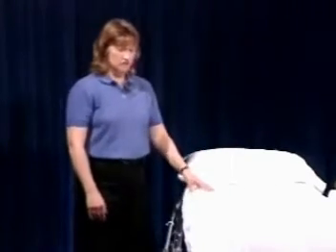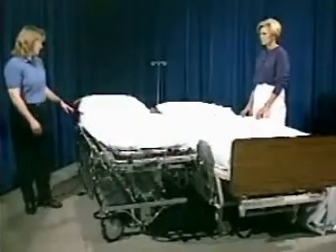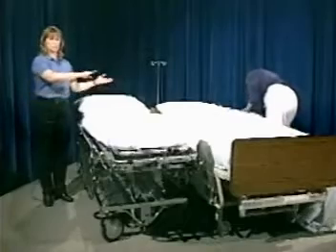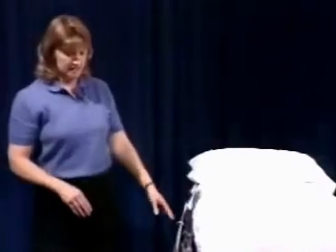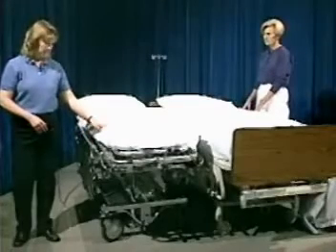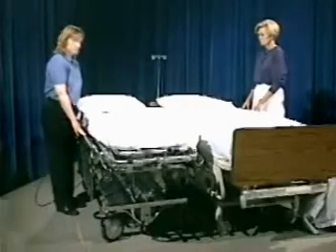With this type of transfer, you need to have the cart or the stretcher flush up against the hospital bed. You need to make sure that you've got the heights fairly even so that you don't have a difficult time moving that patient from one surface to the other. The other thing I want you to be aware of is that these stretchers do have brakes on them. You'll need to make sure that you put the brakes on before attempting to transfer the patient. Make sure that you've got the side rails down before the transfer.